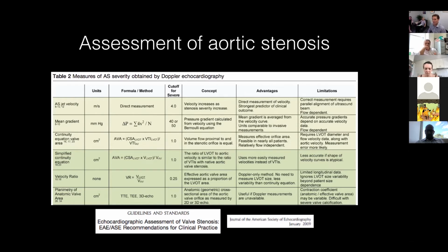My day-to-day experience of that is when I figure out someone's peak velocity gradient, I then ask one of the sonographers to do it, and they always get higher values than me. That's my general experience, and that's because they're better at imaging than I am. Nice.